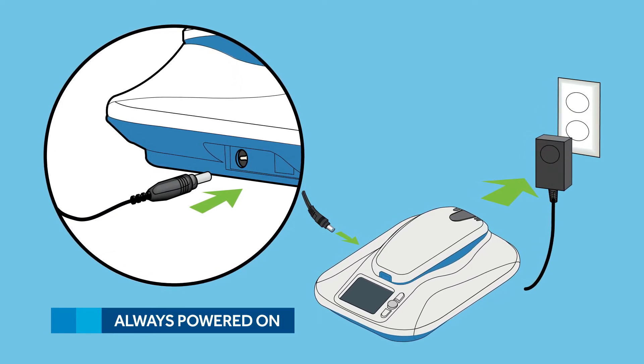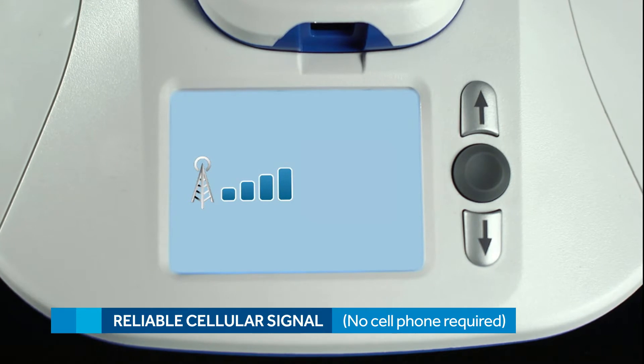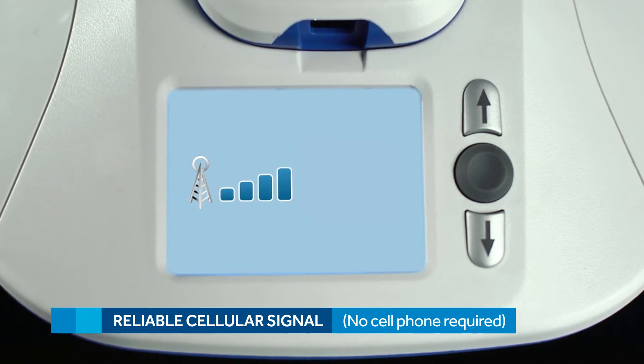By constant power I mean, avoid an outlet that's controlled by a wall switch, since it could accidentally get turned off. And make sure the location you choose receives an adequate cellular signal. A bedside table like this one should work perfectly.